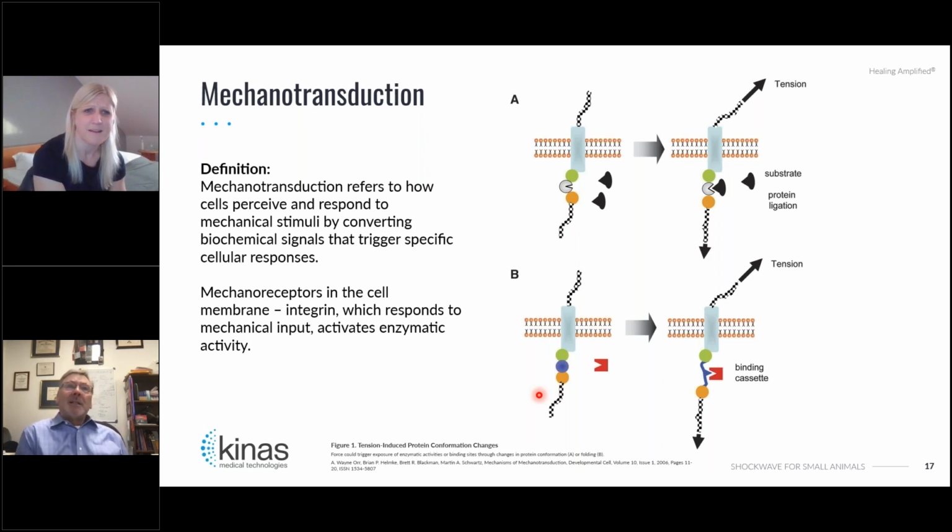Have you experienced that? Yeah, same thing. I think they might look at it for a second or two, and then they go back to laying there and relaxing. The older machines, yes, are much louder. Radial in general, I haven't used every machine, I've probably used 10 different ones, but they all are louder because it's a ballistic or pneumatic generation of the pressure wave. Going back to what you said earlier, where radial maybe isn't really a true shock wave, it's a pressure wave.